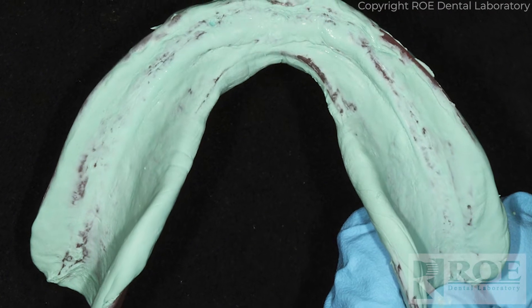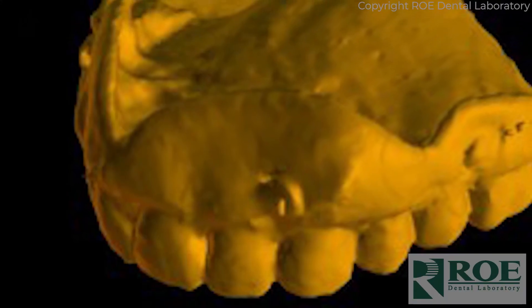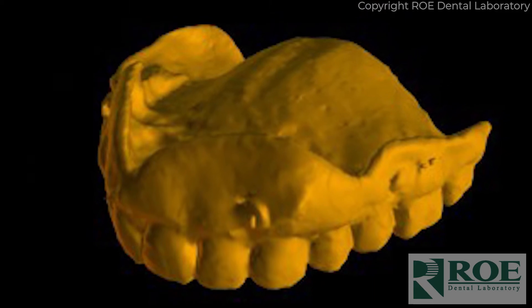In that case, you would load it up with mousse and seat it until it fits just right, kind of like a reline impression. That blue mousse is radiopaque, so it shows up on the CT scan. You could trim away any excess that flowed around the flanges or the facial or buccal of the denture.